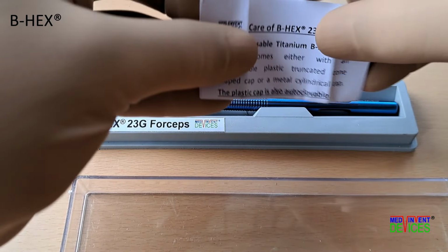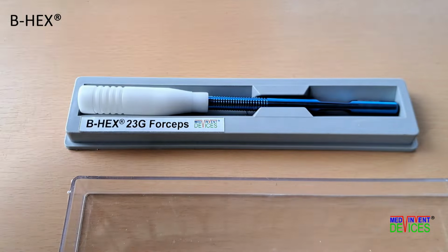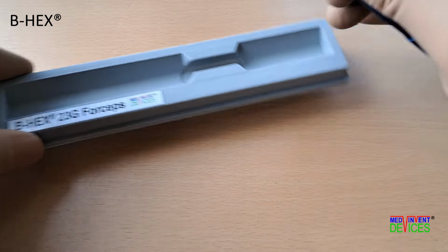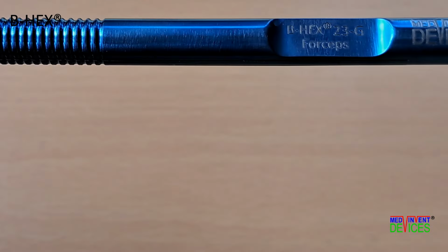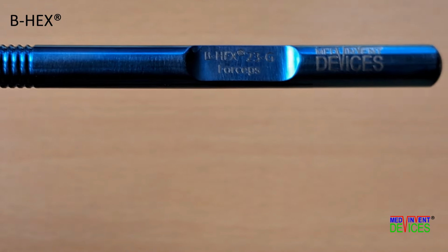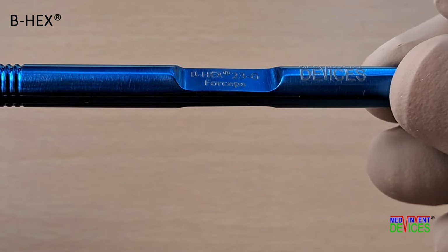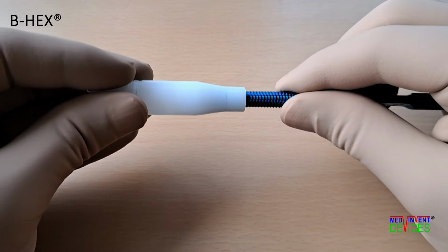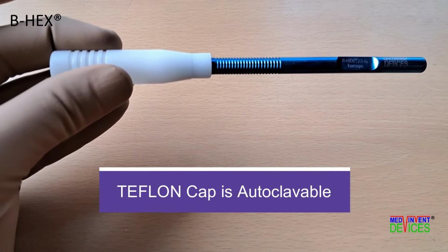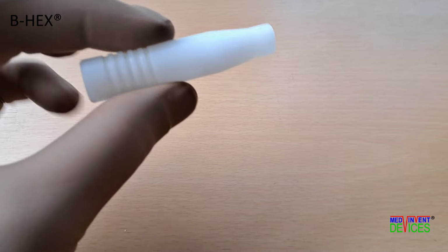Please read the instructions and share it with your operation theater support staff. The genuine B-HEX forceps can be identified by the B-HEX and Med-Invent Devices trademarks. The Teflon cap is autoclavable. Except when in use, the forceps should be capped at all times with this Teflon cap.